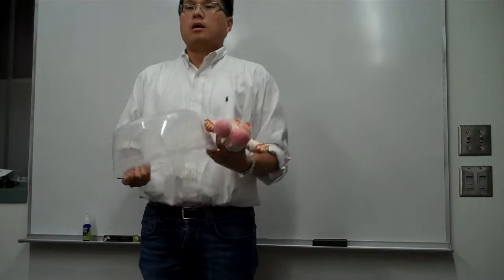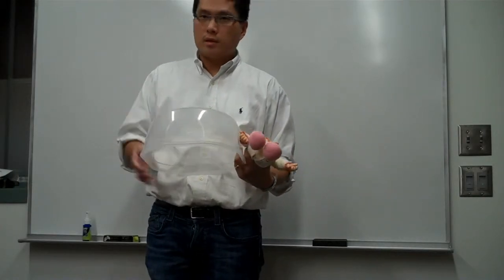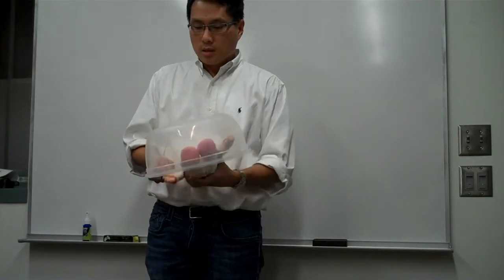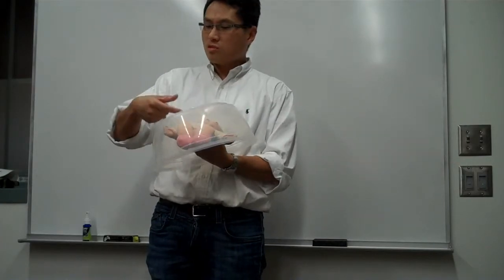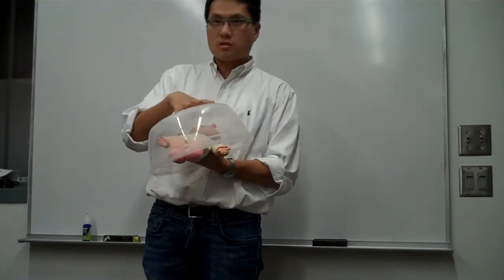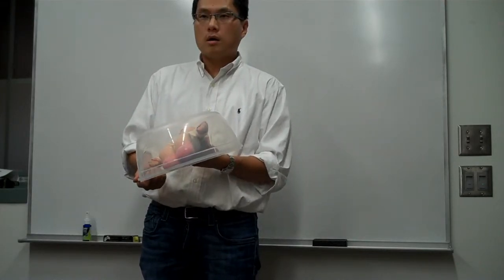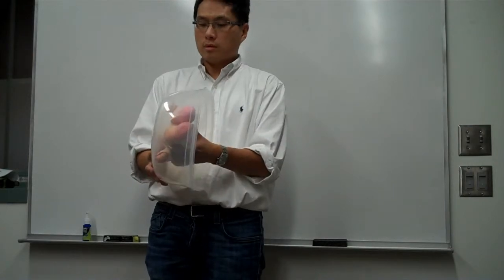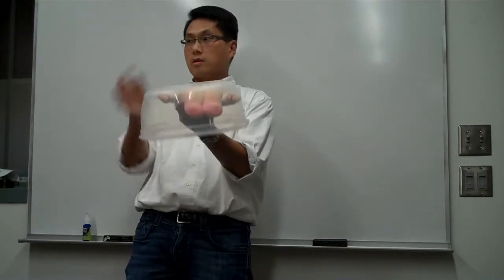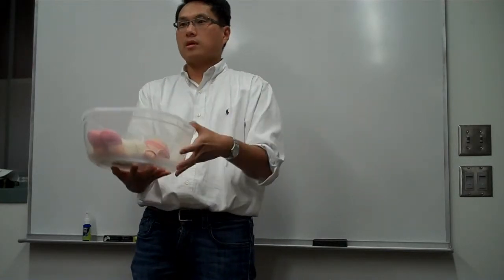Yeah. Does it have to be floating inside the fluid, or can it be suspended? It can be suspended. Yeah, absolutely. As long as it can be, it can be absolutely suspended. Because the only thing the ultrasound cares about is that there's some sort of fluid, water, gel, consistency, whatever, no air pockets, and those depths. Because you can just flip it over too, right? If you flip, yeah. Let's say the back was closed. Yeah. Right. Okay. So you could even have it kind of symmetric, like this. Yeah, that's a good idea. You could just flip it over like this.